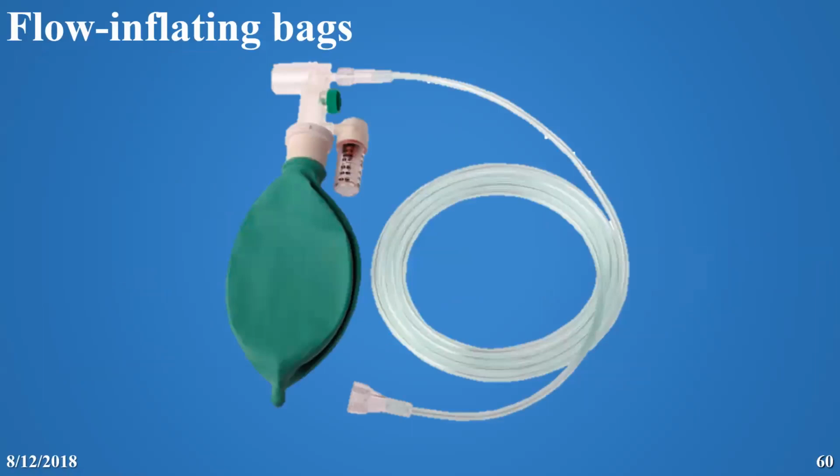The flow inflation bag is very important, but it needs flow. And this is the bag. In this bag, you can hold it by a finger, and there may be a valve, or it may be open and you have to hold it by hand, and it might be closed. You can see the gauge here to determine how much you are inflating, and then you can inflate.